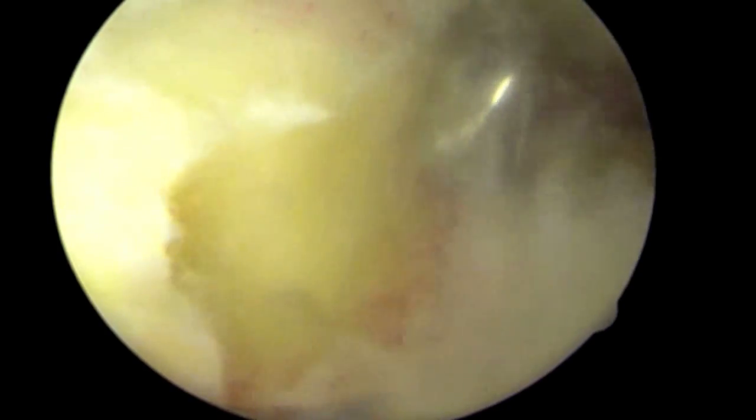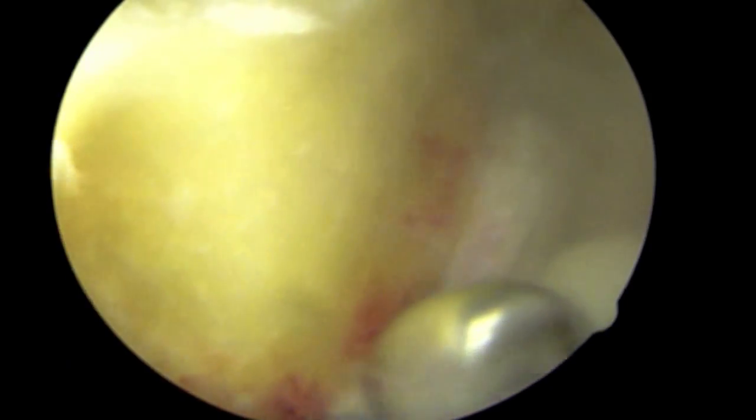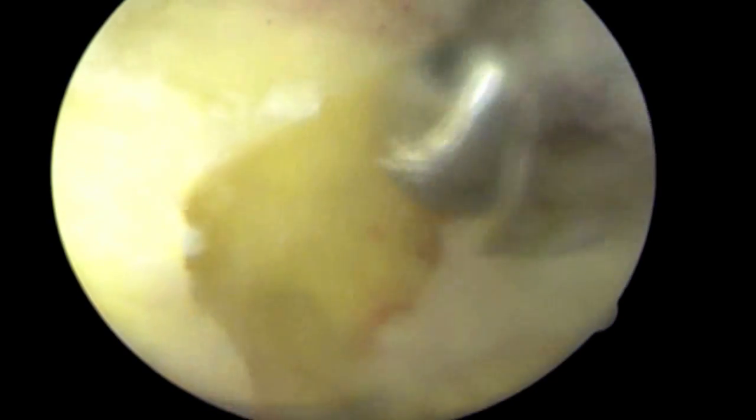On the top of the screen is the articular surface, which had some early damaged focal cartilage injury. The more bottom part of the screen is the side which does not articulate in the joint, which is where the burr is currently reshaping the bone.